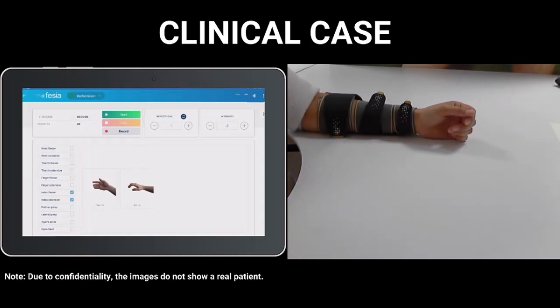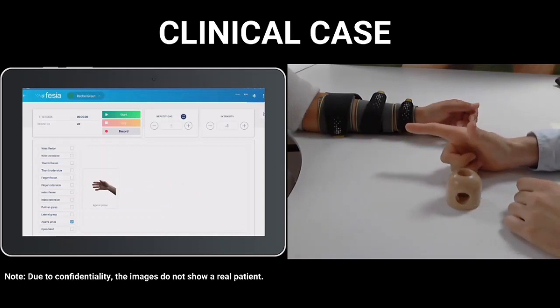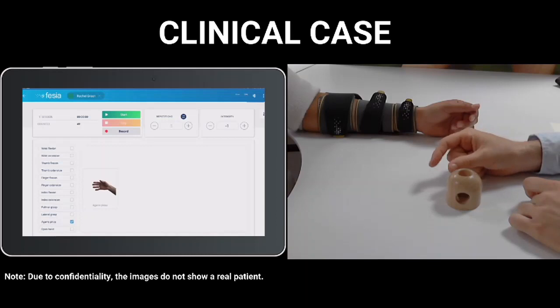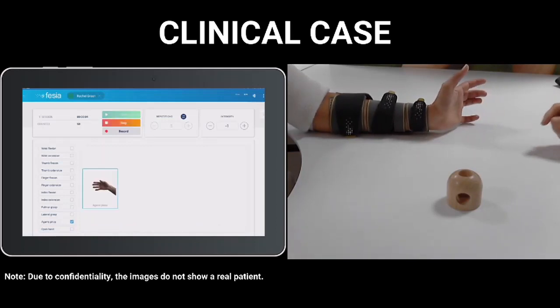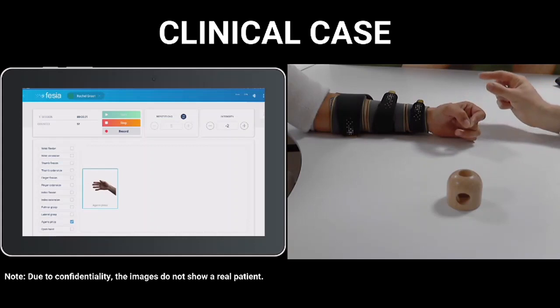For the first one, we are going to select the pinch, which involves, as you know, the extension of index and thumb and the flexion of both fingers. The movement is the following. It extends both fingers, flexes them, and extends them again. Okay. First of all, I will ask Rachel not to produce any movement, only to know which are the times. Two cycles, for example. Now it stops and it will repeat the cycle. That's it. Extension, flexion, perfect, and extension again.